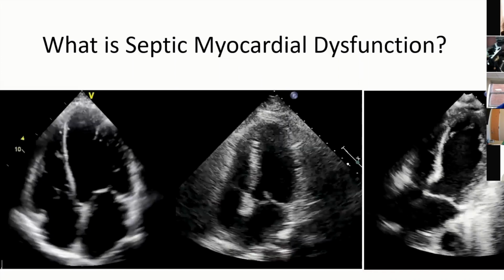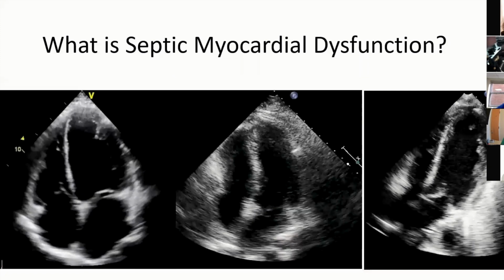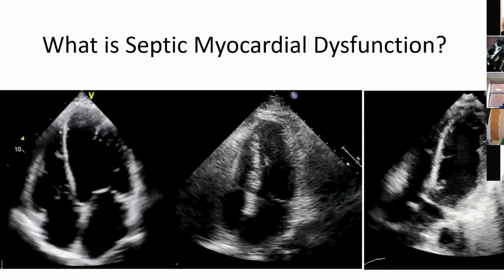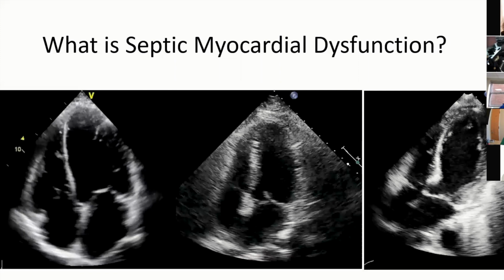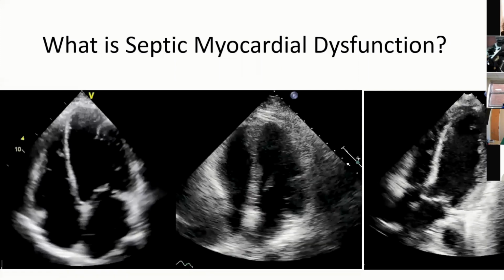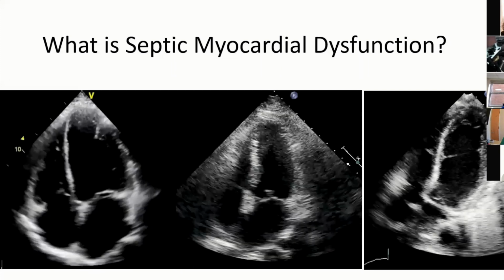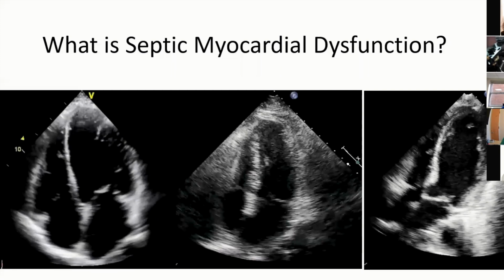Right? And you don't need to know echocardiography to recognize that that thing is not squeezing very well. In the middle, we have a septic heart that's got a low afterload state. It's hyperdynamic. You can see that it's contracting vigorously. And you might think that's normal or perhaps even great contractility, but I'll show you later on that there's some assessments that can show that this is actually impaired contractility.